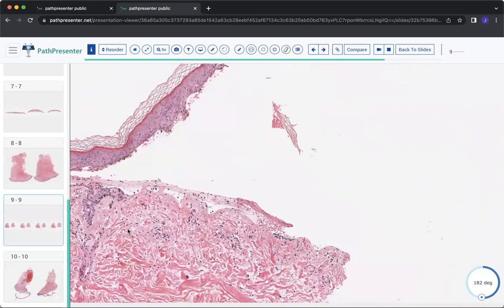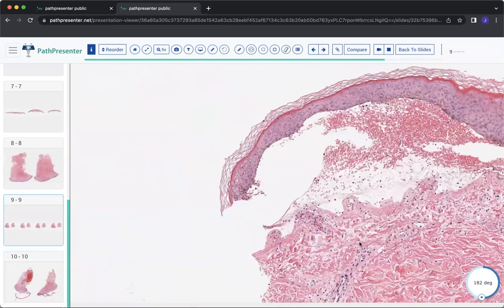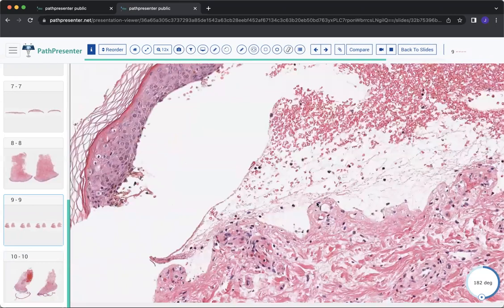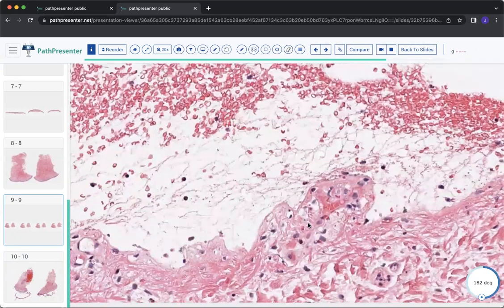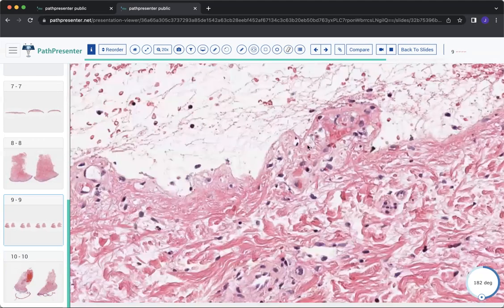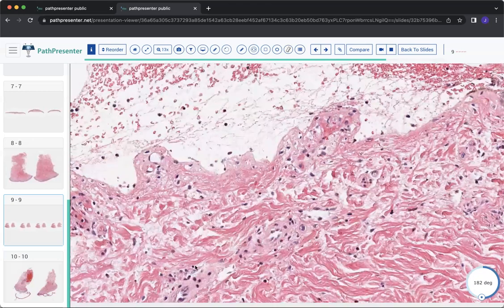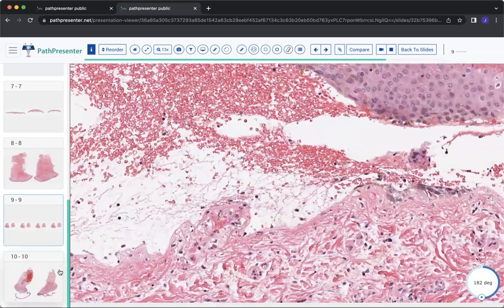All right, so that's epidermolysis bullosa acquisita, and you should understand the role of salt split skin in helping to differentiate between bullous pemphigoid, the variant of pauci-inflammatory. Now, if you were just given the choice without DIF information, you should go with an EBA here because it doesn't have a lot of eosinophils, and so that makes you think that it's not the classic bullous pemphigoid that they would show you on an exam.